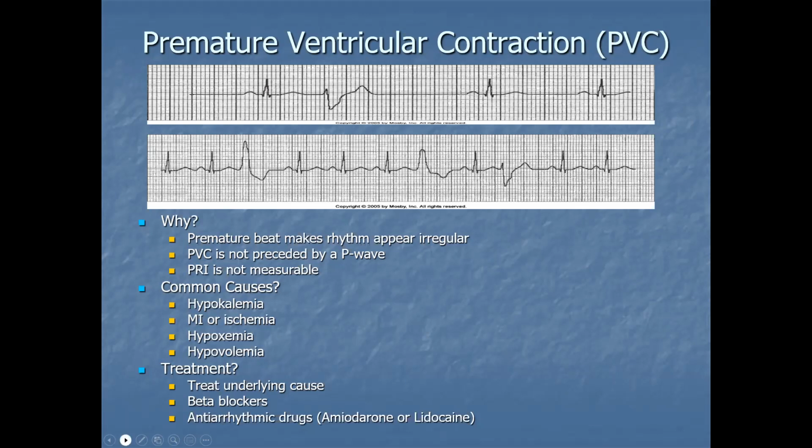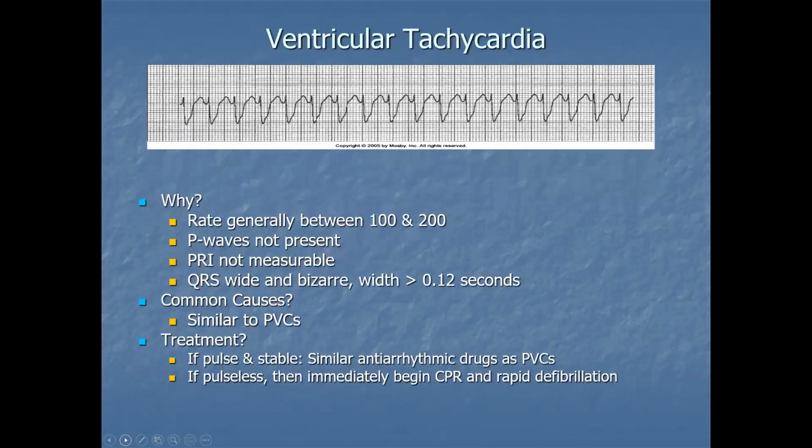Ventricular tachycardia is potentially a lethal rhythm. If a patient's in ventricular tachycardia long enough, the ACLS protocols basically say if the patient's conscious, if they're quote unquote stable, and they're in ventricular tachycardia, it means if they're alert and oriented, if they stay in this long enough, they're probably not going to be. So the idea is if you recognize this and it's real, it's not a test question, it's really happening with a real patient, we need to get them out of this as soon as possible.